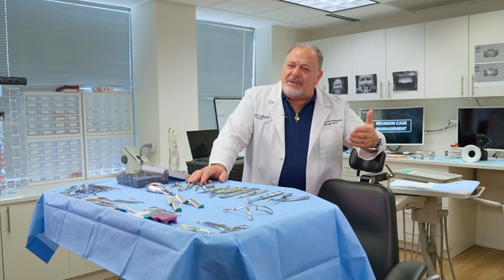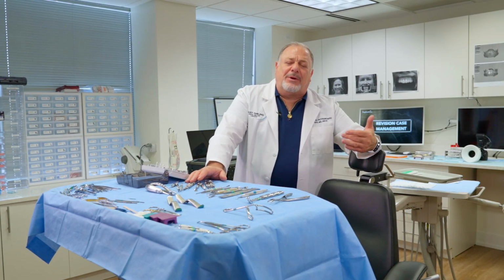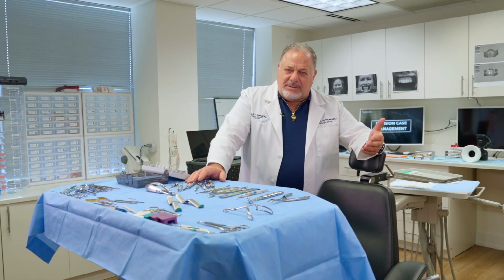We're going to do all the same things we would do from a digital workflow. So when our patient comes in, we do our initial scannings. Well, we do our consult first. We review the case with her. We talk about what's happening. We tell her what our plan is.